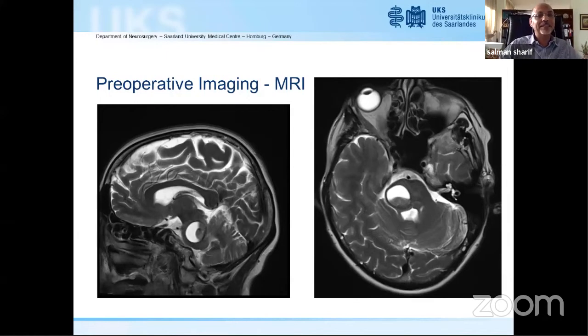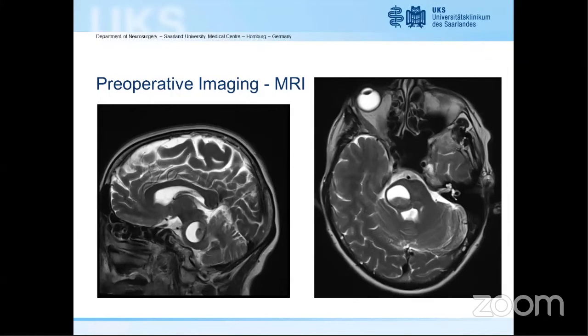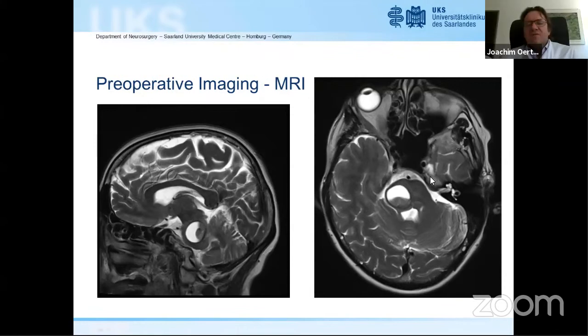Okay, we have Francisco again. So let's see what he has to say. Maybe we could use another view of the MRI, maybe a SWI, to see if we have hemosiderin, or maybe an angiogram, an angiography. There's a little hemosiderin rim. You might not see it very well here. A little bit darkish.